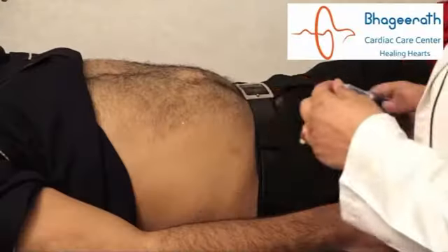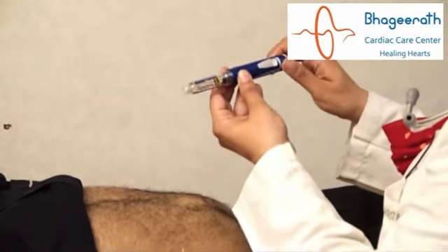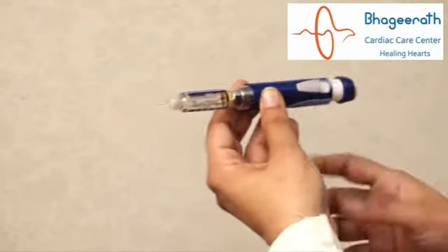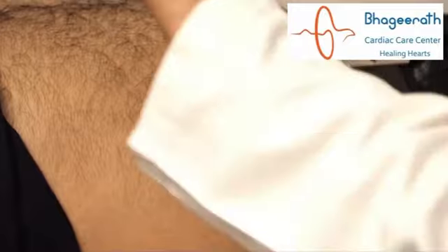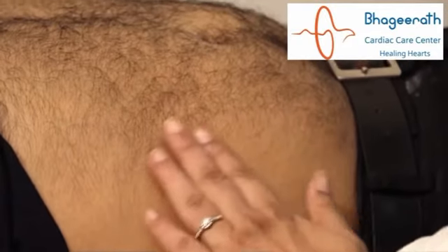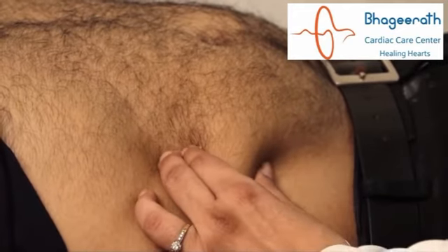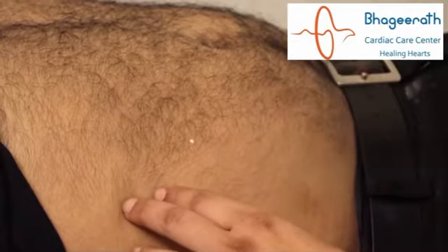When using a pen, you should dial the desired amount of insulin, say 20 in this case. Now you have the site ready, you just have to pinch it. Pinching requires just 3 fingers and you pinch slightly. You don't have to dig deep and get the muscle out. You just want some subcutaneous tissue, so you can inject the insulin. Just pinch it slightly and make sure that the injection and the pen go straight in at 90 degrees.